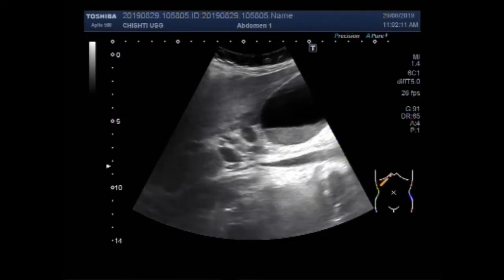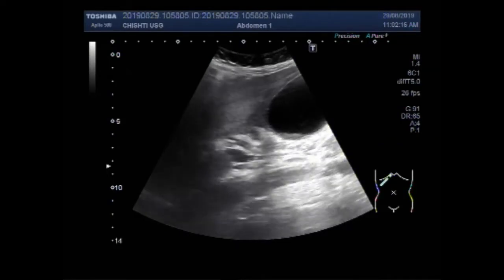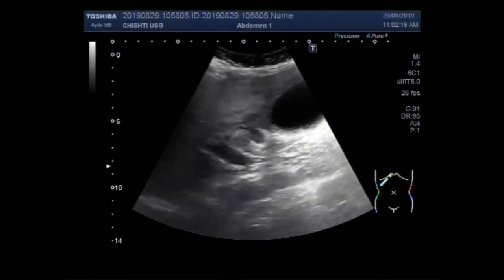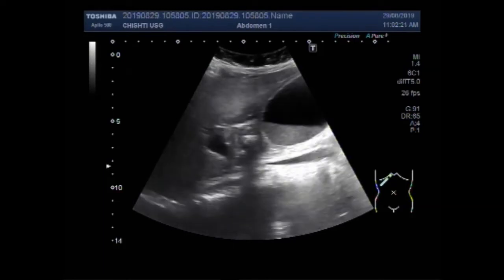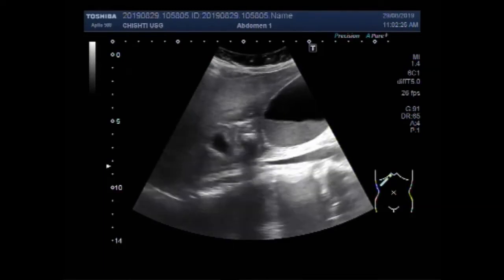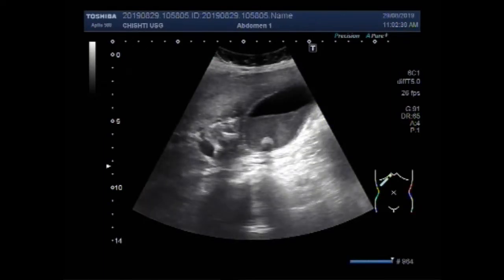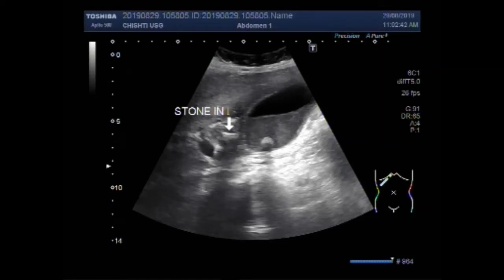I will try to show you both the stones in one image. Now you can see both the stones. This is the stone in the bile duct — that is choledocholithiasis.